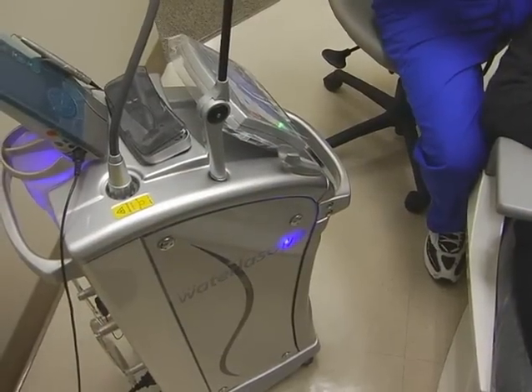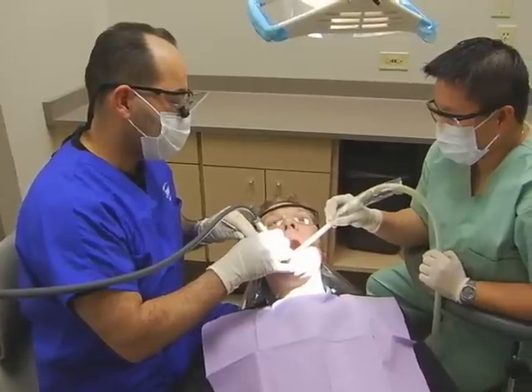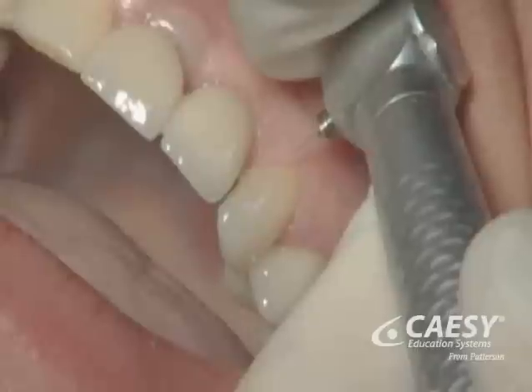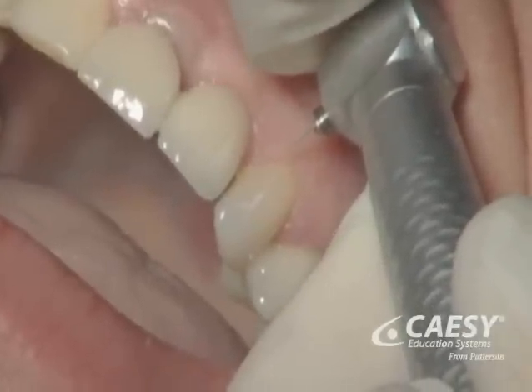Periodontal surgery is something that can always be done after less invasive procedures are offered. And in many cases, laser-assisted periodontal therapy is the perfect alternative. Basically, when we see a patient that has early to moderate phase of periodontitis, we offer them scaling and root planing combined with 2 to 3 episodes of laser treatment and localized dose of antibiotics in the pockets.